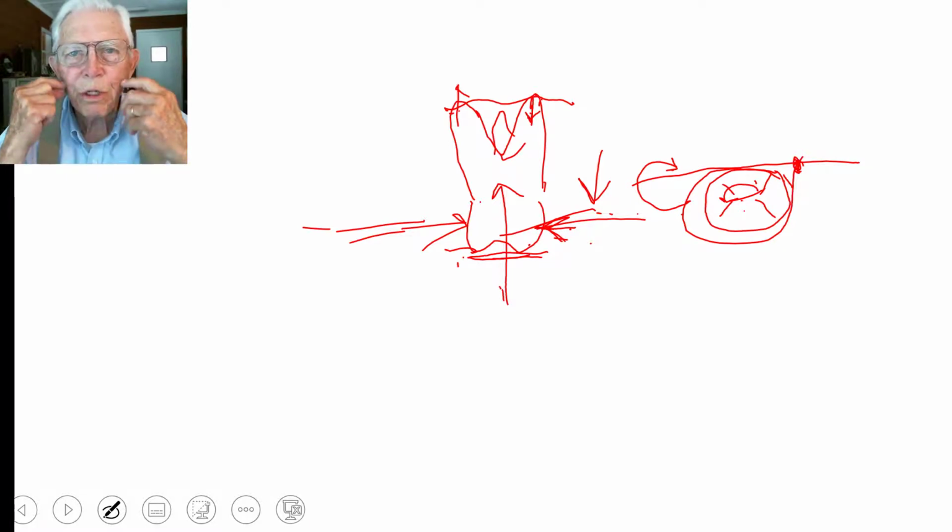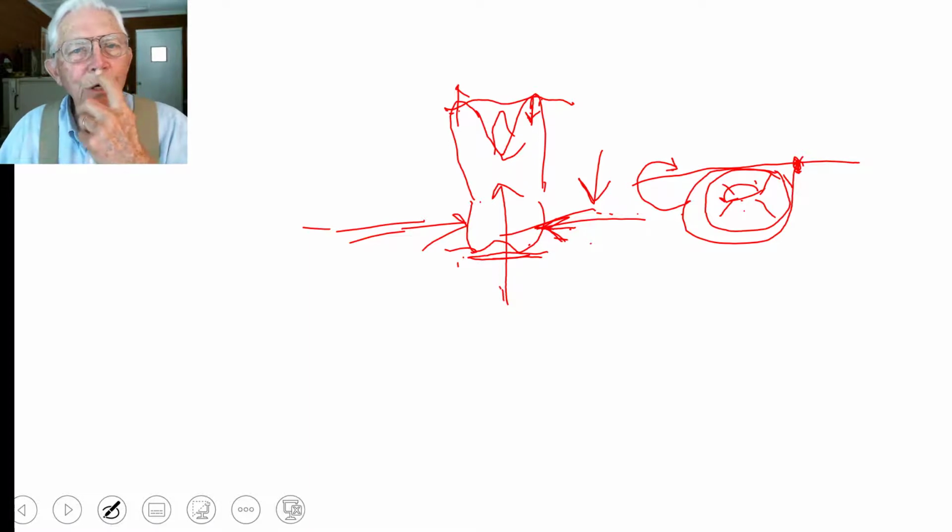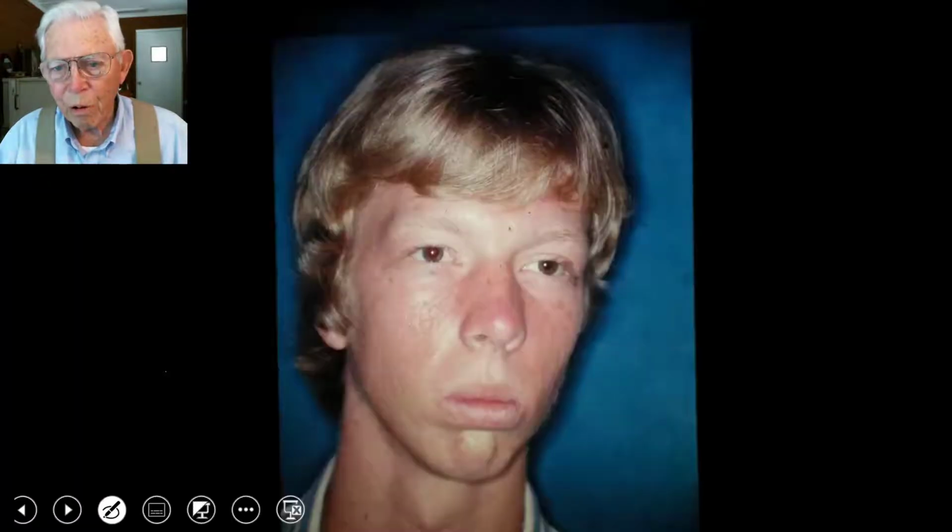So we have to put something to try to push the jaw up a little bit, or to put pressure on it to keep it from increasing the high angle case. So I hope that simple, just hard to pass on all of this.